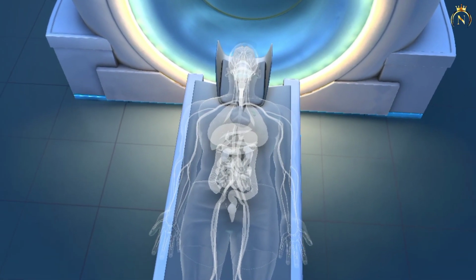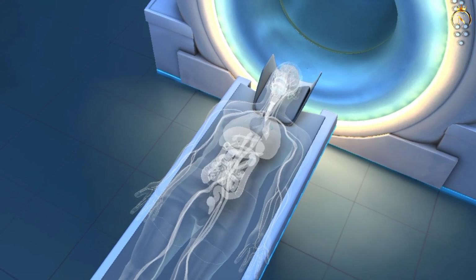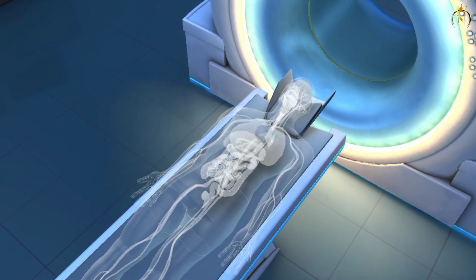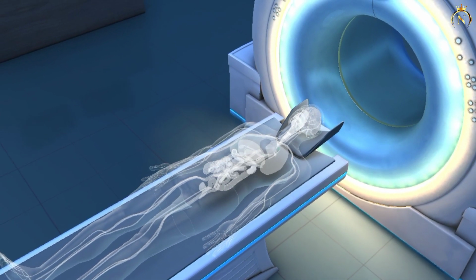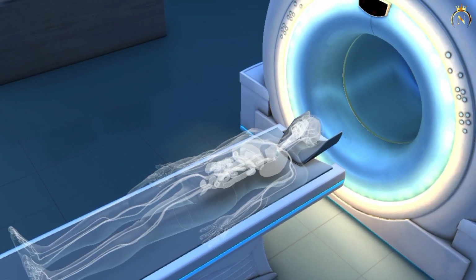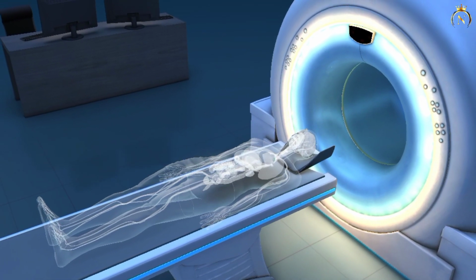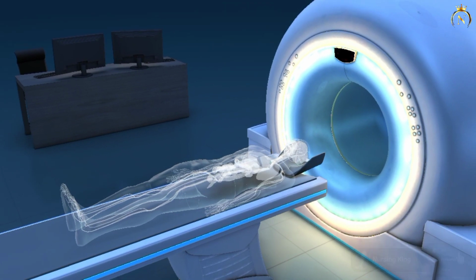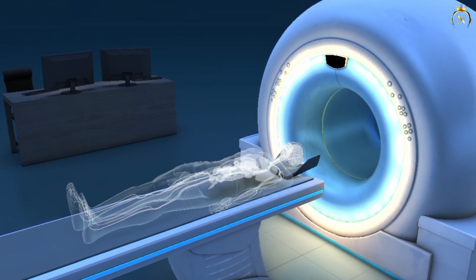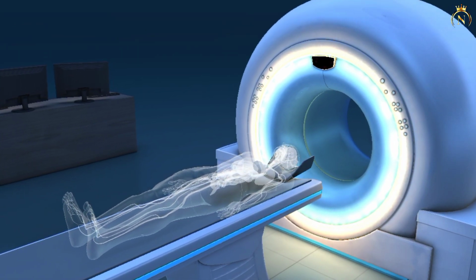a particular tissue. When a disease develops in an organ, functional disorders appear first. Anatomical changes only present in a later phase. This is why PET is so helpful in diagnosing diseases at an early stage. PET is most commonly used to detect tumors, but it is also used to find neurological abnormalities and measure blood flow in the coronary arteries.